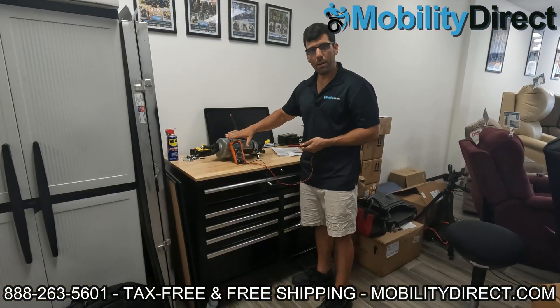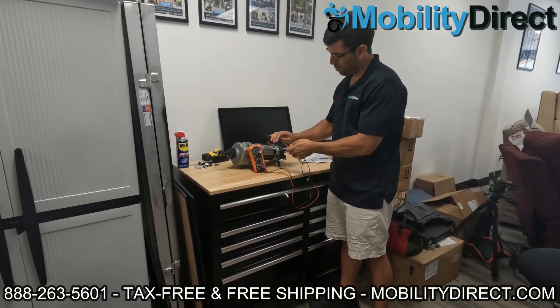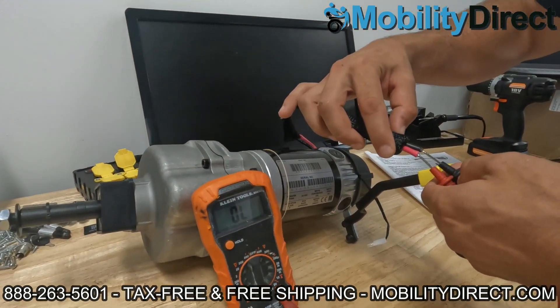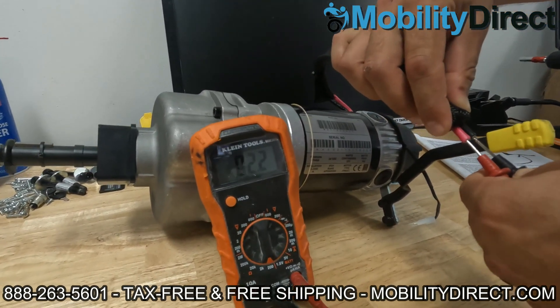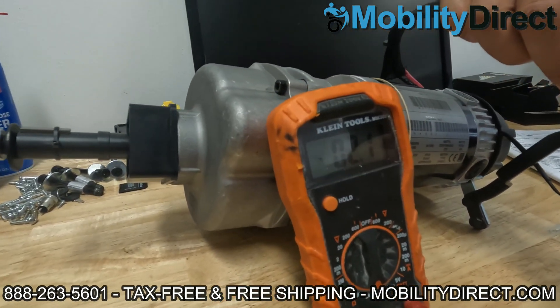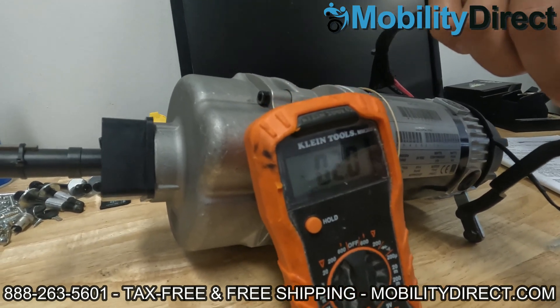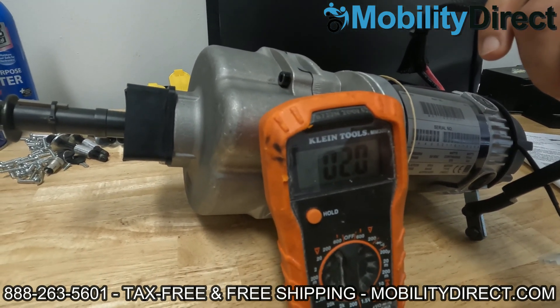I'm going to prop up the multimeter here so that you can see it, and I've changed the position of the motor a little bit to make it easier to hold. When I plug my red probe into the red wire and the black probe into the black wire, we can see on the screen we're getting about just over two ohms — about two ohms. And that's normal. That's where it should be. Every motor is going to be different; this is a pretty big motor, so having two ohms is normal for this motor.